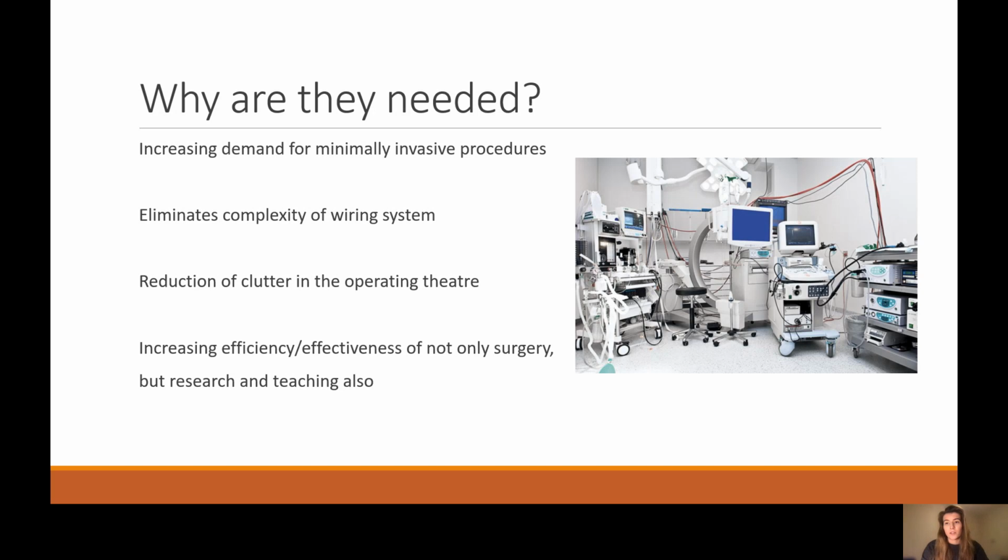Typically, there would also be a circulating nurse changing any settings at the surgeon's request. So these are things like light positioning, pressure on the insufflator, or taking pictures mid-surgery. With an integrated system, all of these are able to be controlled from one central control system on a touchscreen, with even the ability for the surgeon to have a command console and change the settings within the sterile field.